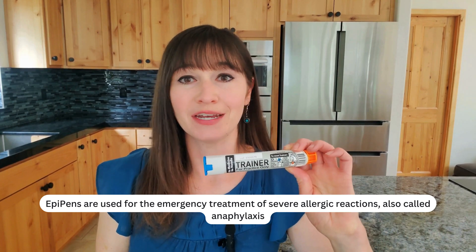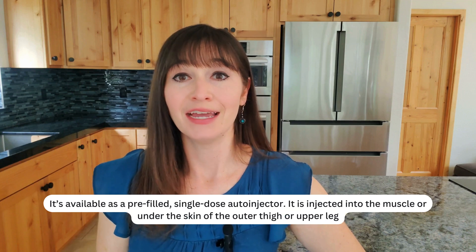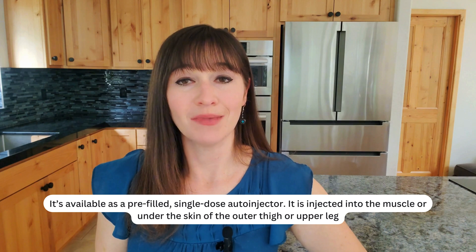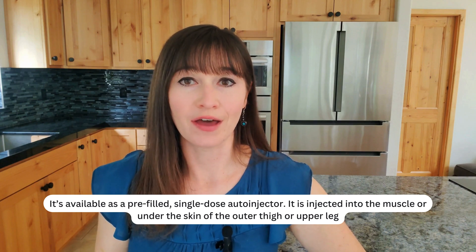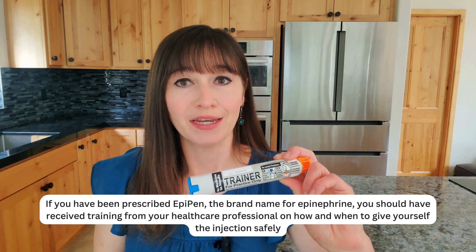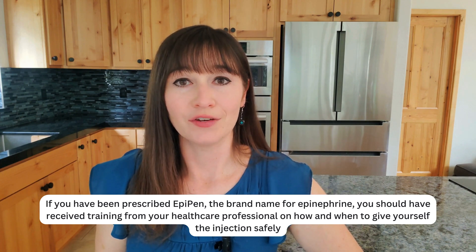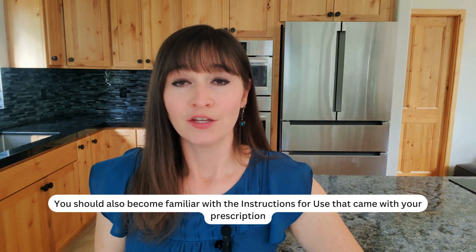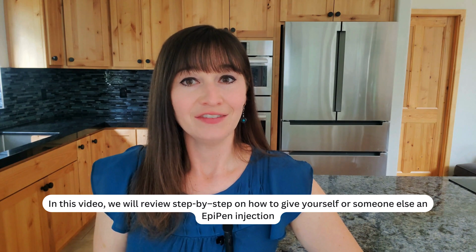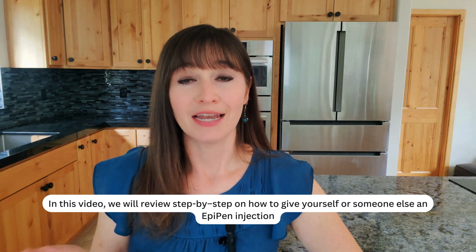EpiPens are used for the emergency treatment of severe allergic reactions, also called anaphylaxis. It's available as a pre-filled single-dose auto-injector, injected into the muscle or under the skin of the outer thigh or upper leg. If you have been prescribed EpiPen, the brand name for epinephrine, you should have received training from your healthcare professional on how and when to give yourself the injection safely. You should also become familiar with the instructions for use that came with your prescription. In this video, we will review step-by-step how to give yourself or someone else an EpiPen injection.